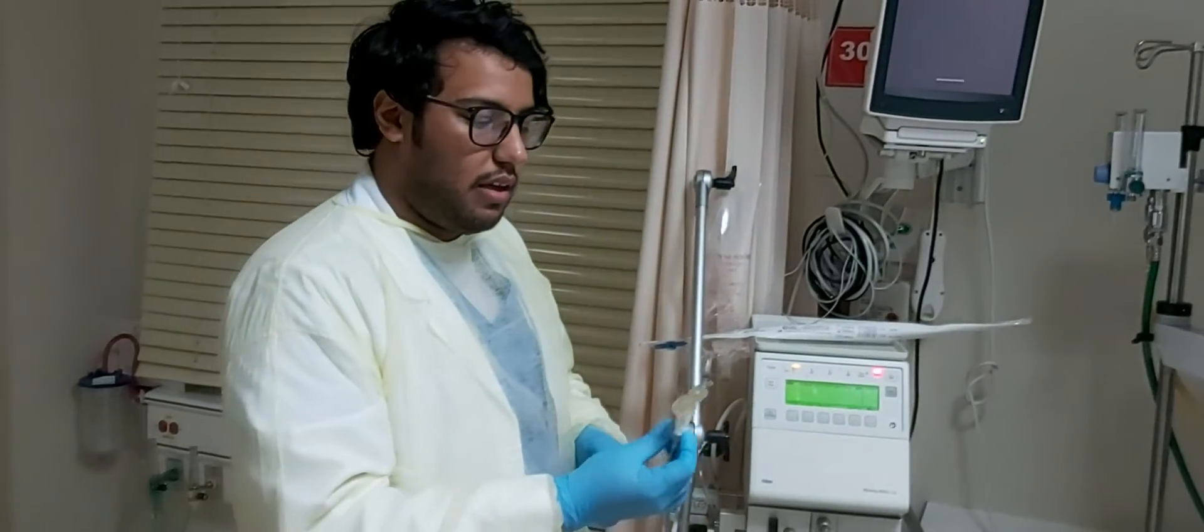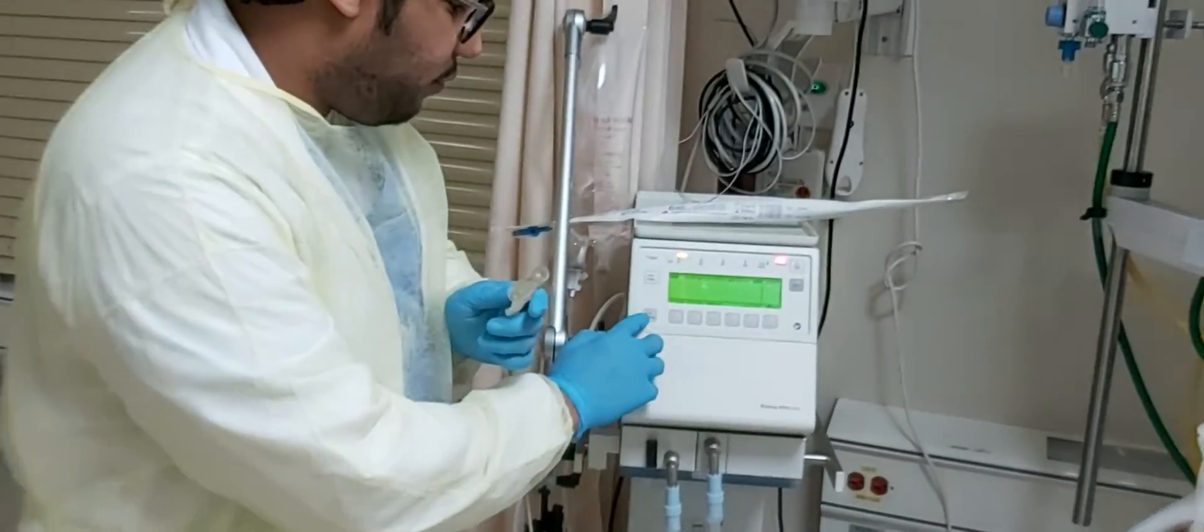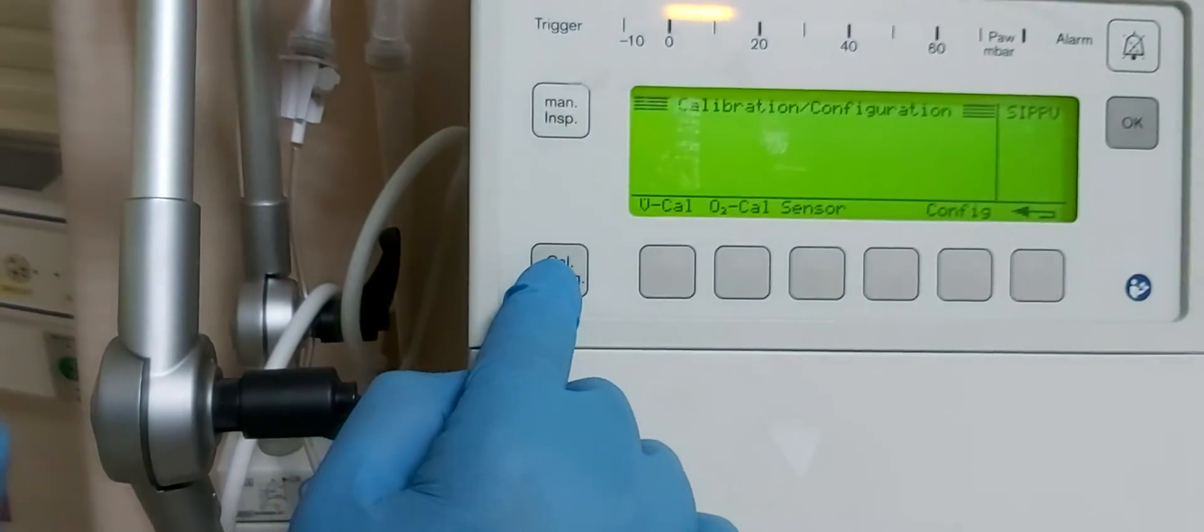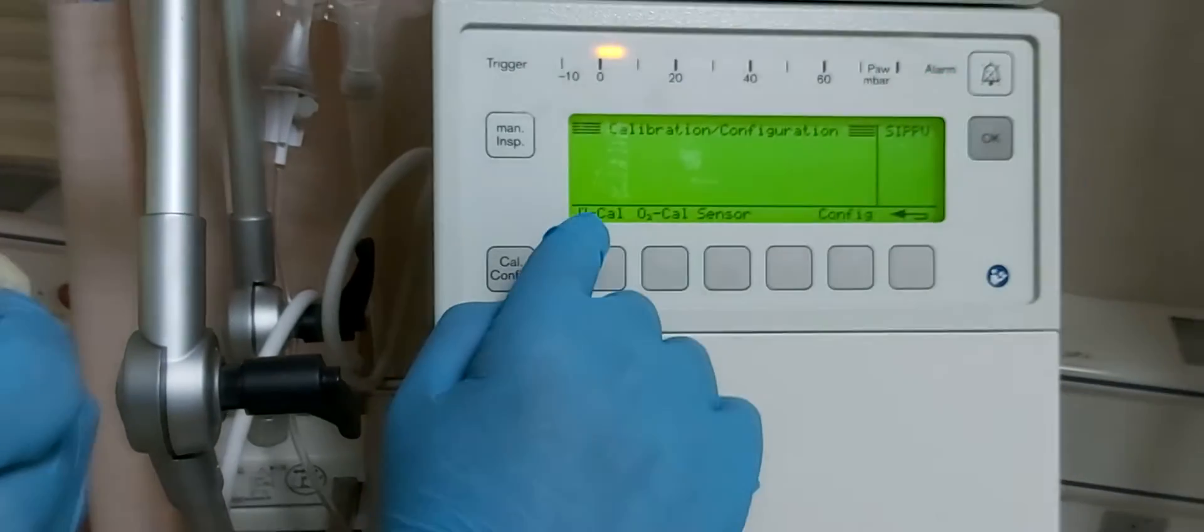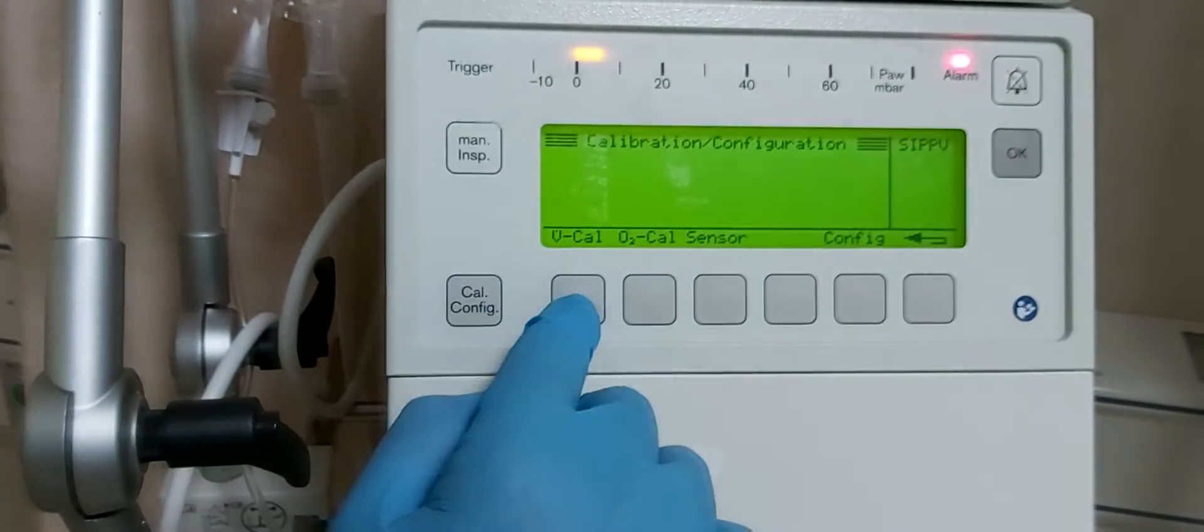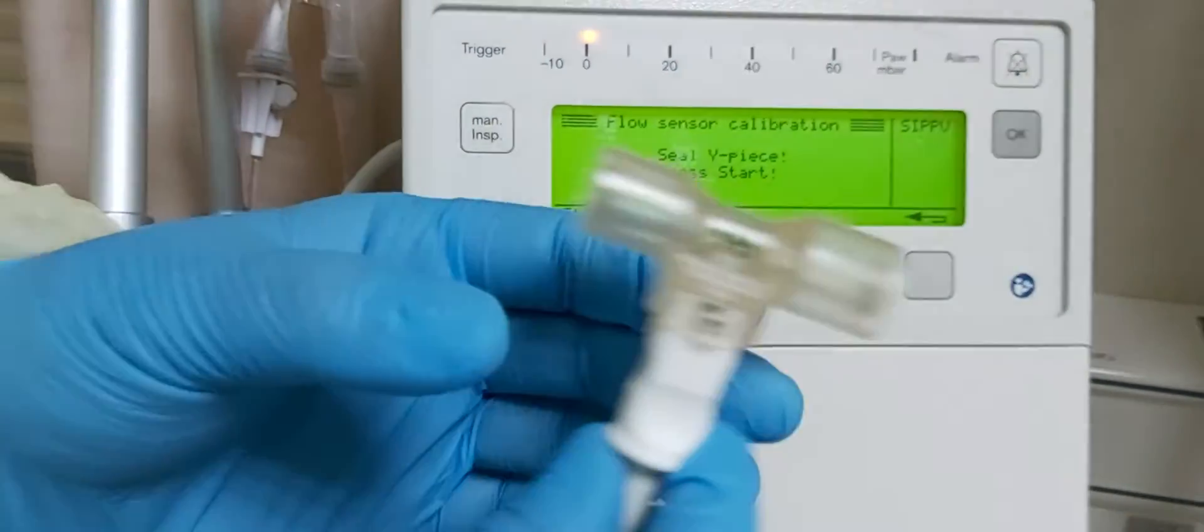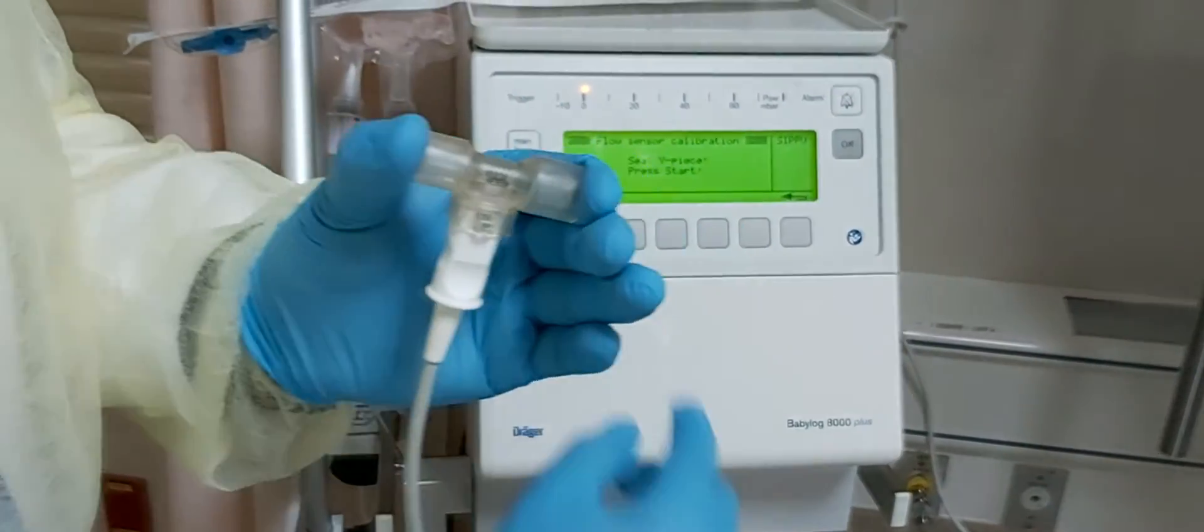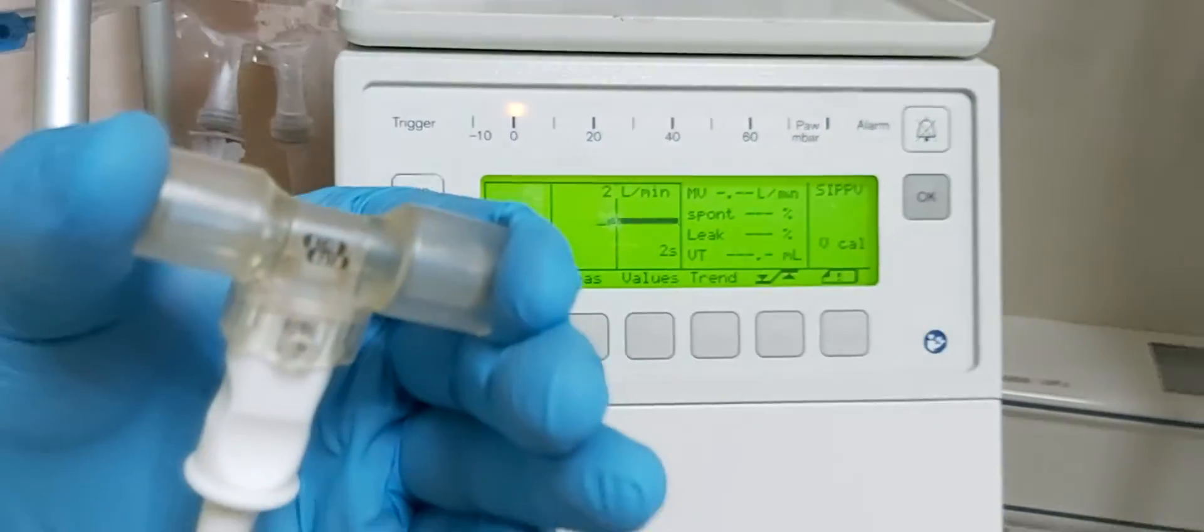How we can calibrate the flow sensor: we go from here, that button for calibration, and we press for flow sensor calibration. We have to close from both sides the flow sensor and press start.